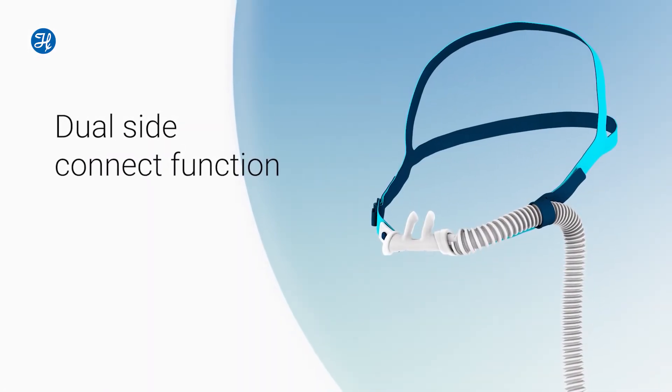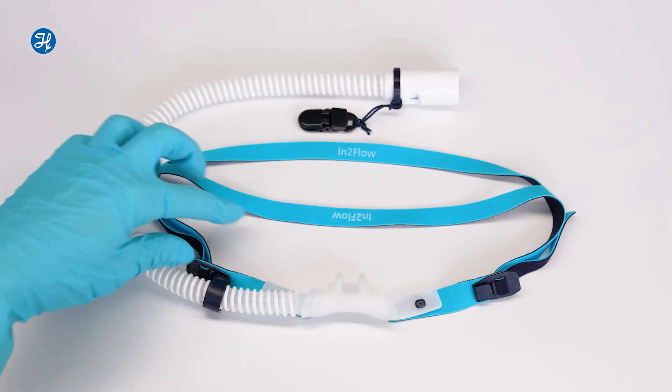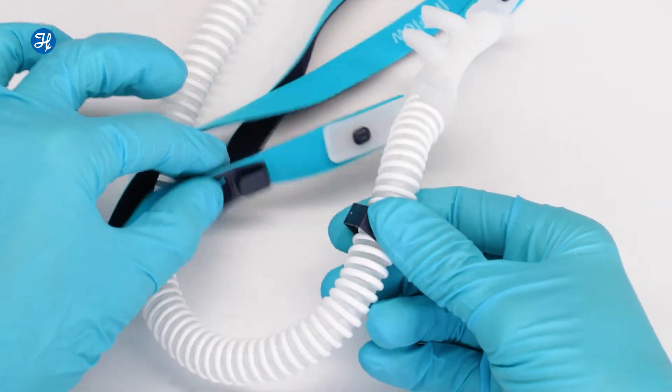The dual side connect function means you can connect the delivery tube on either side of the face mount, depending on where the device is positioned. To change sides, first unclip the headgear from the delivery tube.